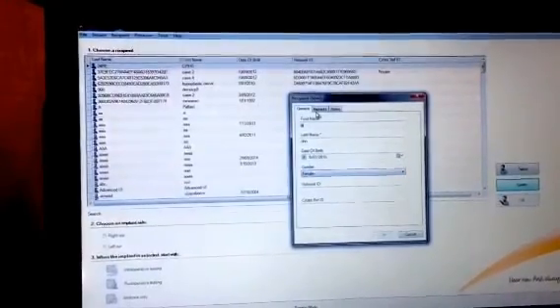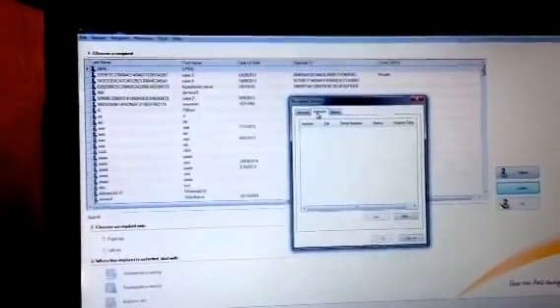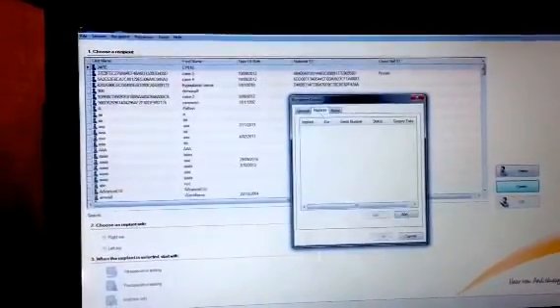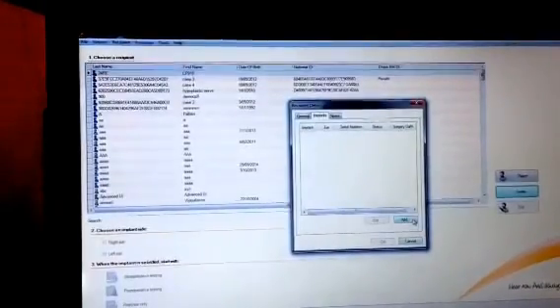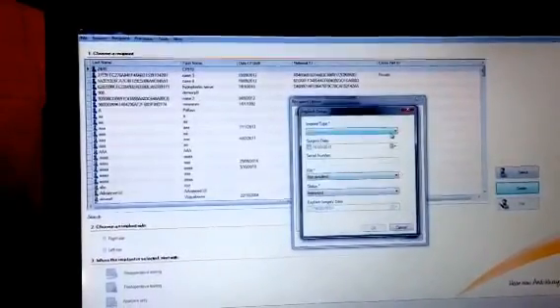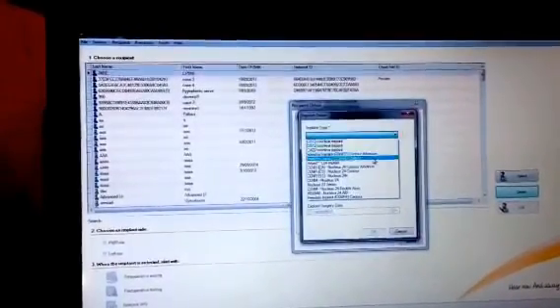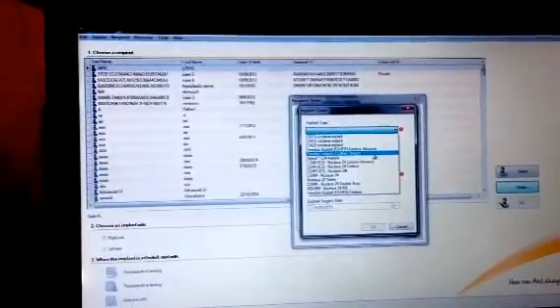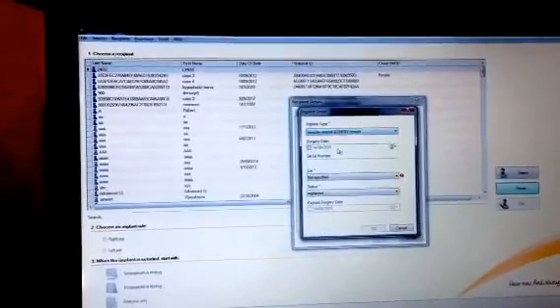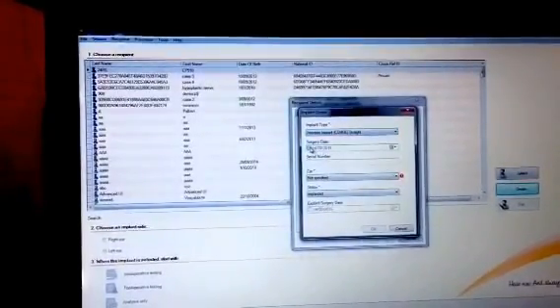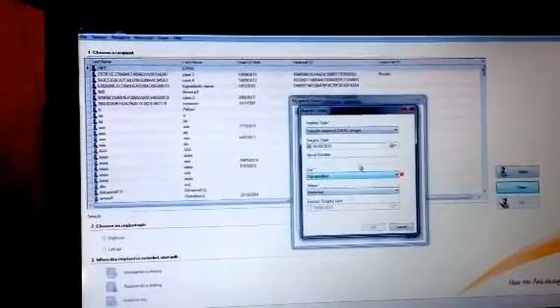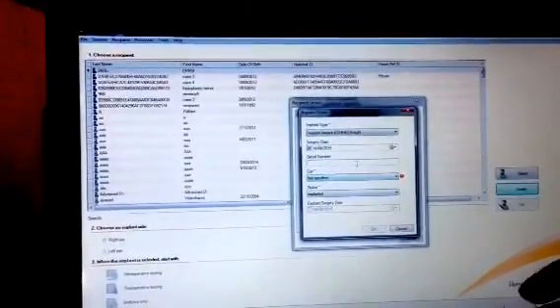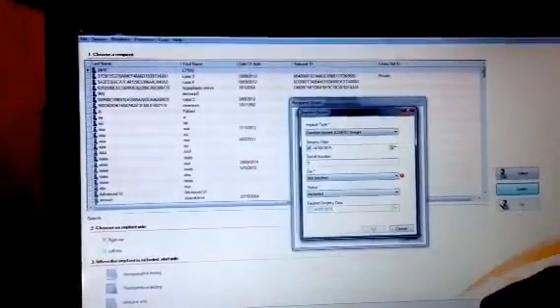The other thing that is really important for us to add is the implant details. When you add the implant details, you would have to tick on the box that it is a Freedom implant. And you will have to tick on the date of the surgery.